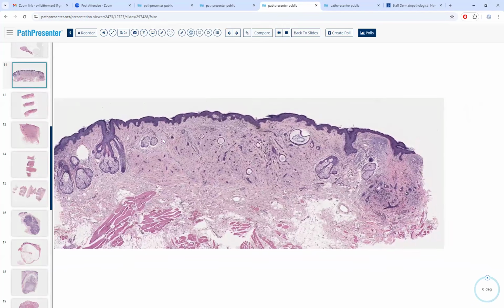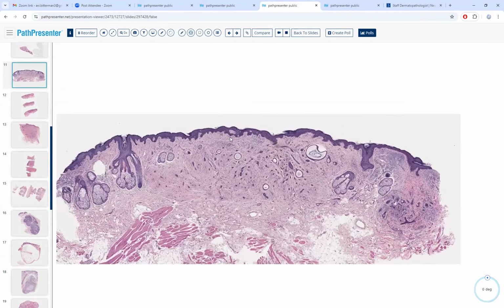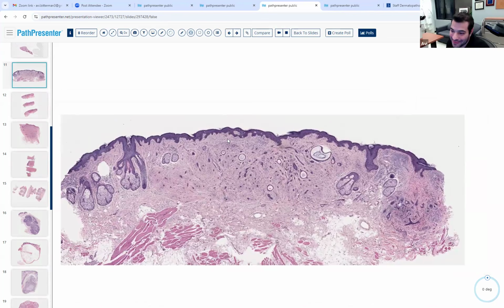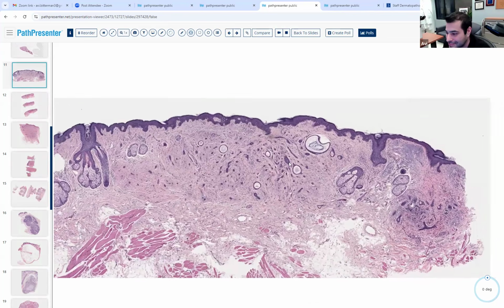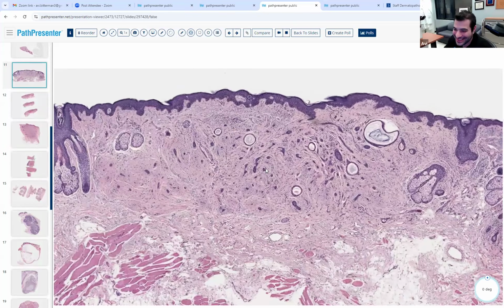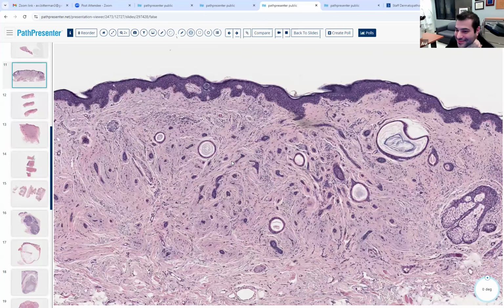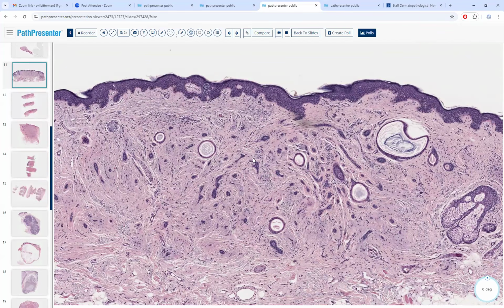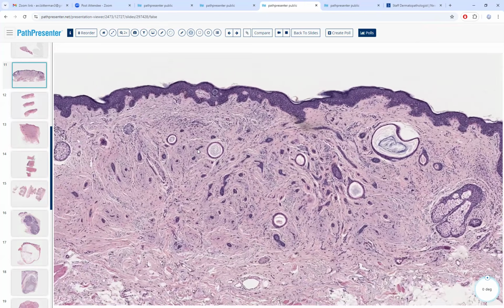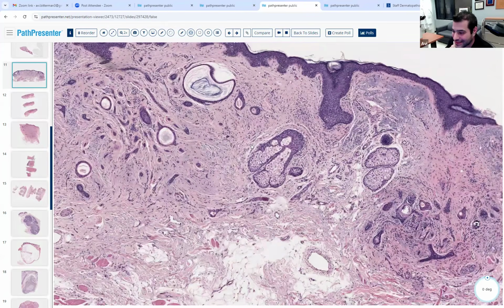All right. Does anyone see a central dell? No. I don't see a central dell. So DTE is out, right? Allegedly not. Nope. All right. So what do we see? That looks like a horn cyst, not like inspissated sweat. Okay. Horn cysts. I agree.